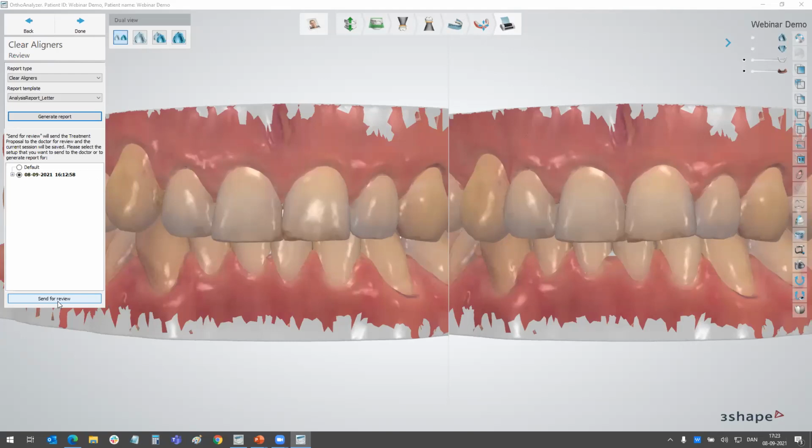It's still a little bit of a nerdy feature that requires some work on the lab side. So far we see that it's mainly the bigger labs that want to dive into that, but we just want to make sure that we had the functionality ready. But this is by no means plug and play, what we see so far, but I think it will get there very soon. So it's definitely something worth keeping an eye out for.